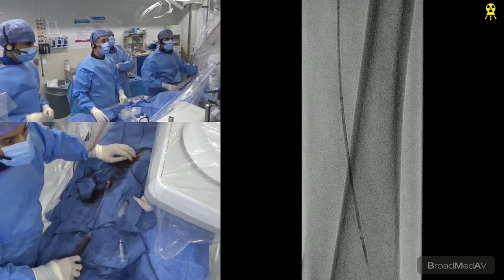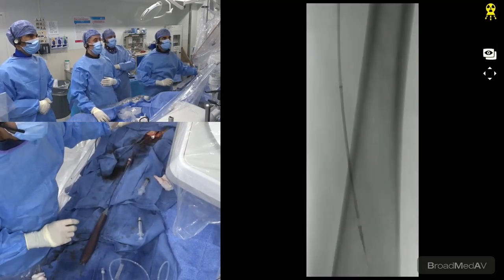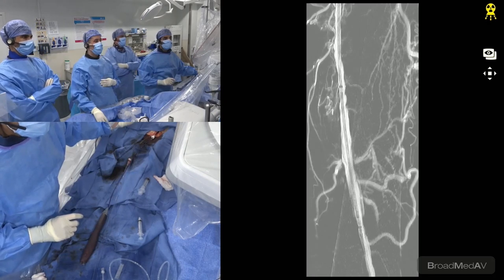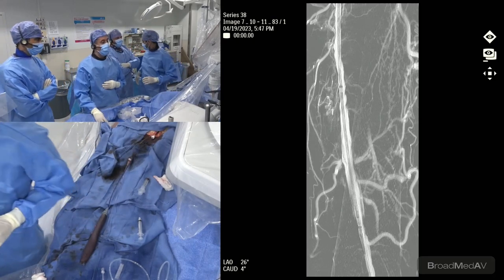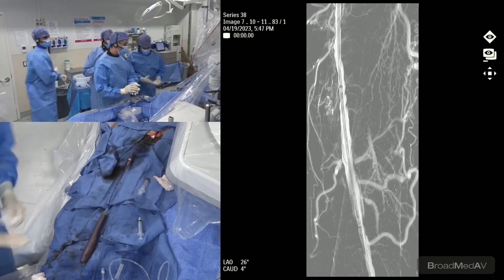Good. Okay. Now we're going to go ahead, come off it. You can even do a roadmap again. Okay, roadmap on. So since we're planning on stacking it, we're going to be a little long there. That's okay. Nope, we got to go further down. Yeah, way down. Right there. Oh, you're perfect. Maybe you guys go a little bit down.